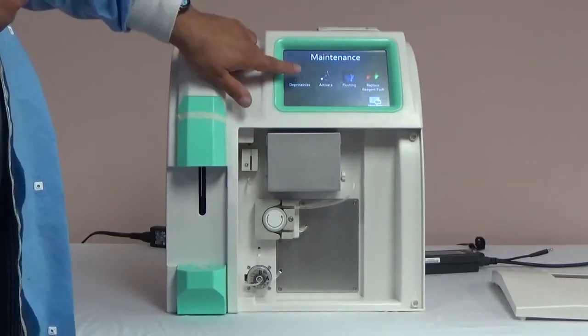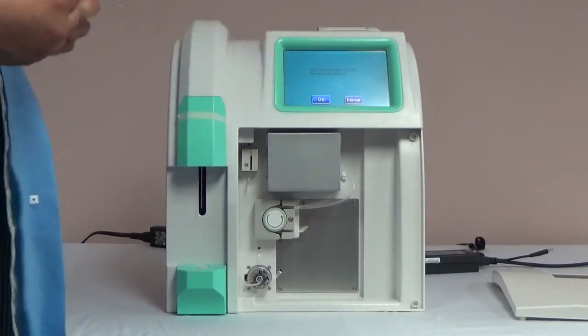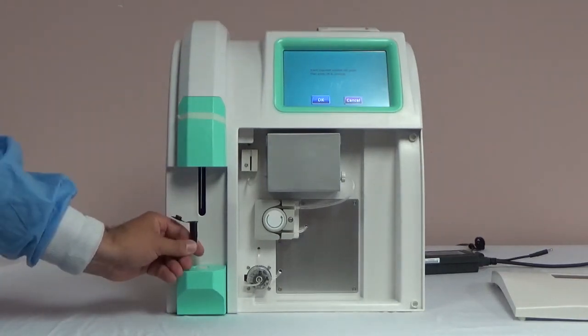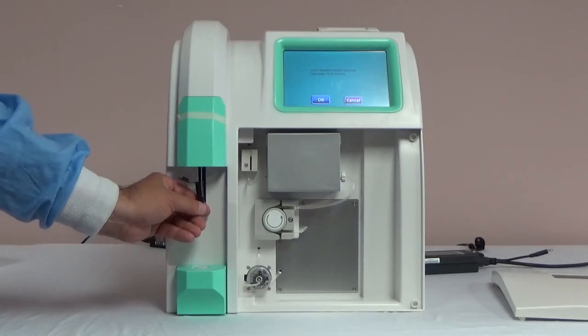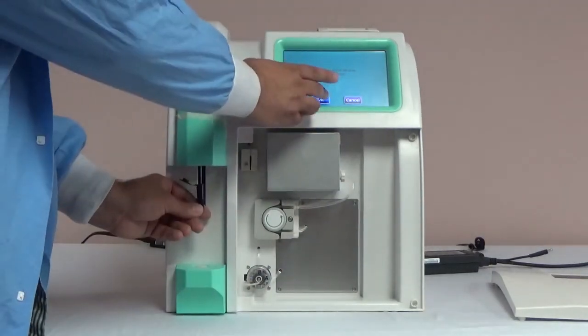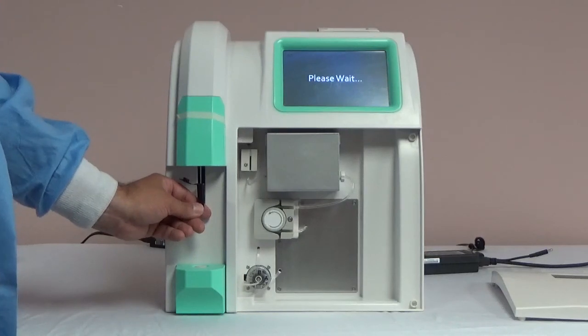After 5 minutes, begin the deproteinization process by selecting maintenance from the main menu, followed by deproteinize. The analyzer will ask you to insert the solution into the probe. When you insert the solution, do not push it all the way to the bottom of the vial. If you put the probe too close to the bottom, the probe will not be able to aspirate enough solution. Once it aspirates, the analyzer will tell you to remove the solution and it will run the process.